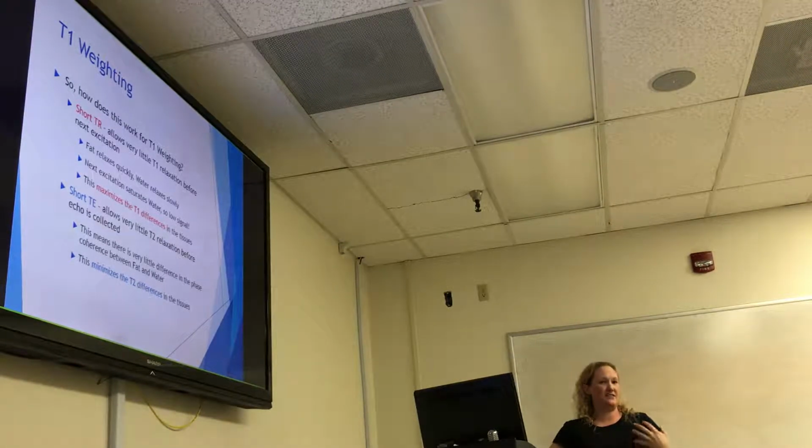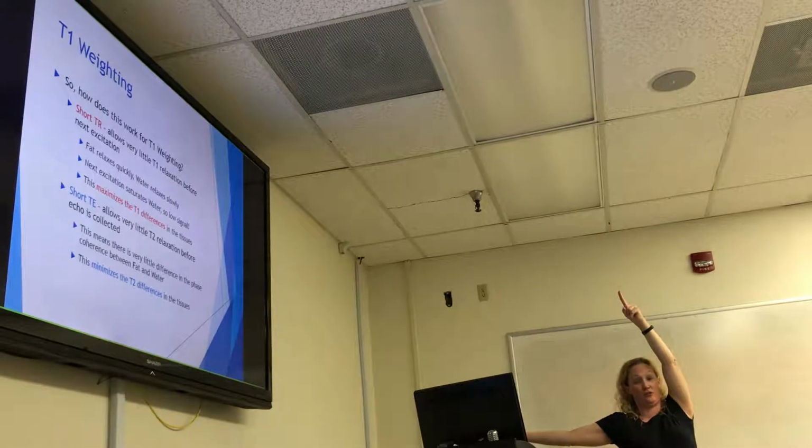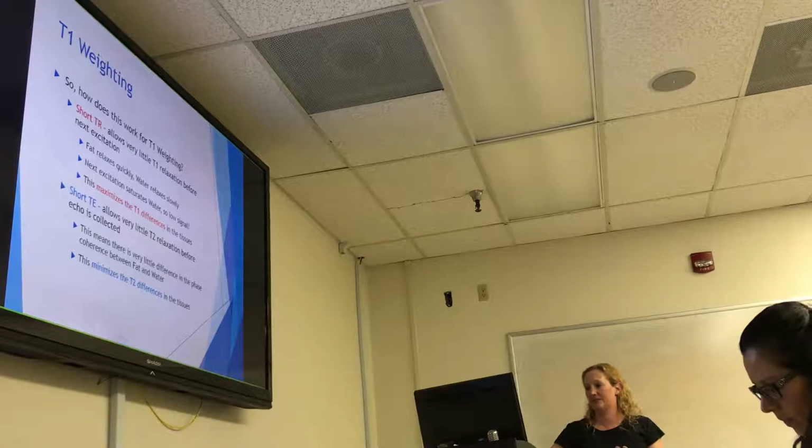So that's why we need that short TR, so that we have that big difference in our T1 relaxation between our tissues. So we're maximizing those differences.